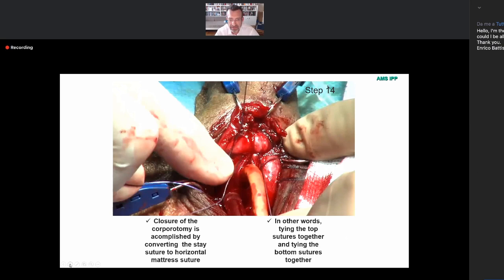Next slide, Enrique. Also, in the revision, I had a lot of problems with the Dacron in the revision of the penile implant. That's very important to keep in mind.